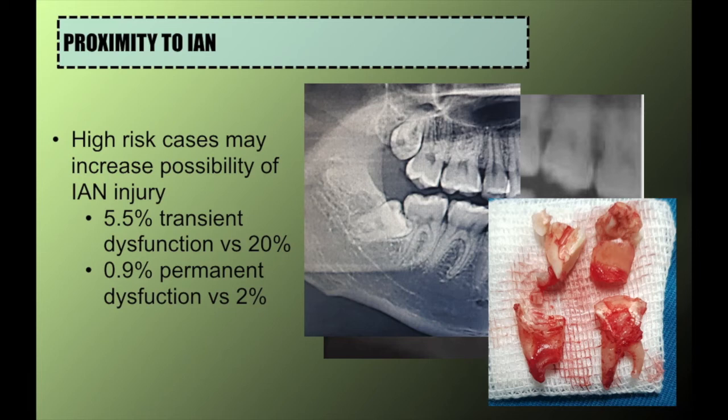After careful removal in this case, the case showed a tooth that had notching, grooving on the distal root, and a completely separate mesiobuccal and mesiolingual root. Now, I would assume the IAC ran in between these roots on the mesial part of the tooth or root. Fortunately, this was removed without any nerve dysfunction on the part of the patient.